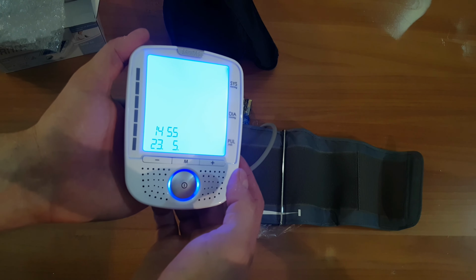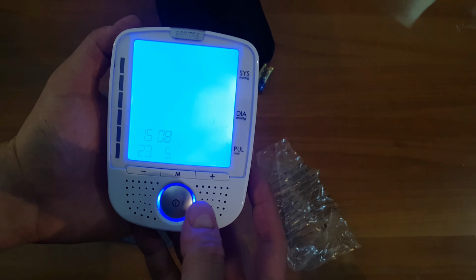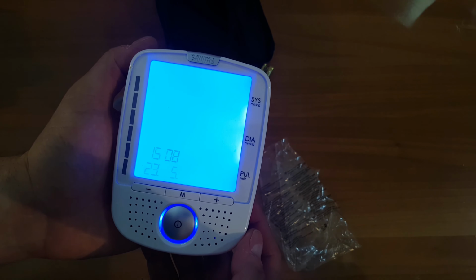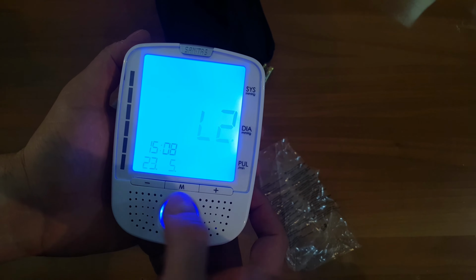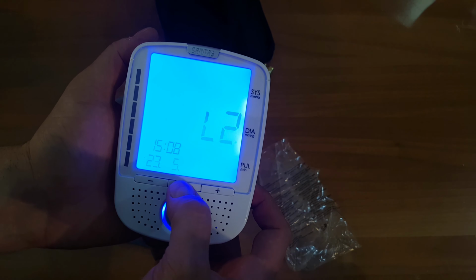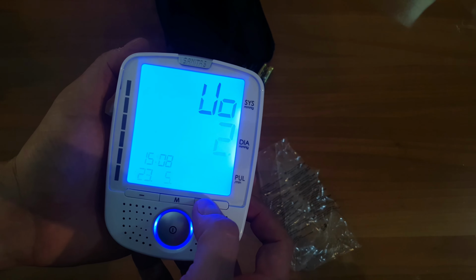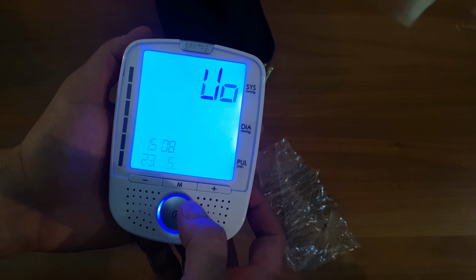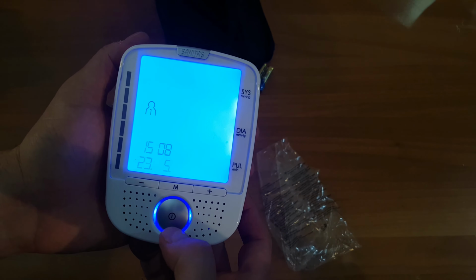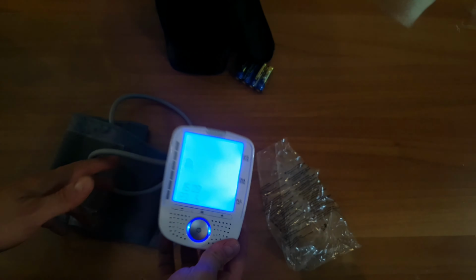And for changing the language, one is Portuguese. Okay, that was Portuguese before. L2 is English, and we are going to leave it on English. And again M, and this is the sound. How much volume do you need? 0, 1, 2, 3. I will leave it on 3. And M. And the device is ready for testing.